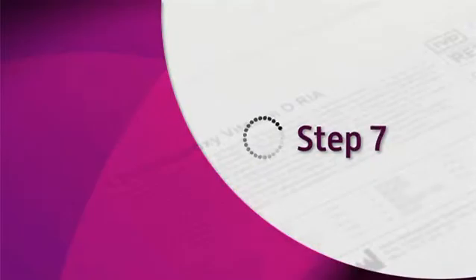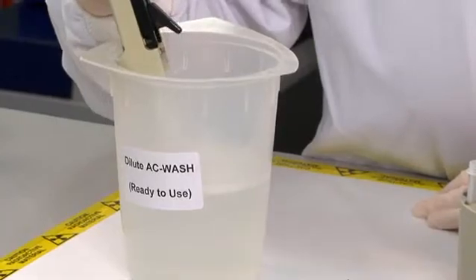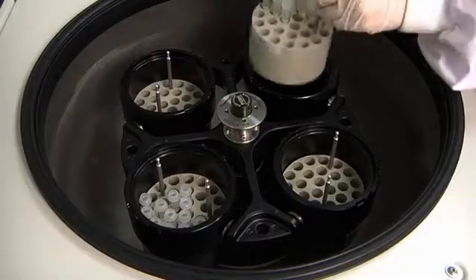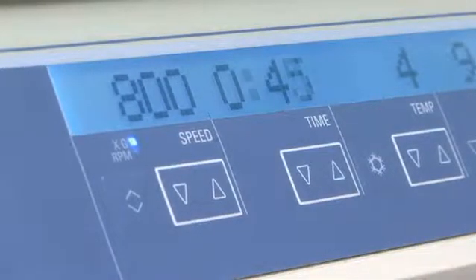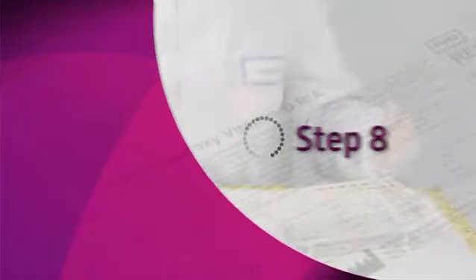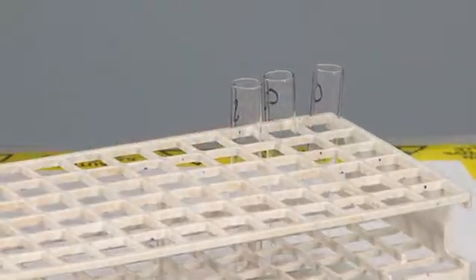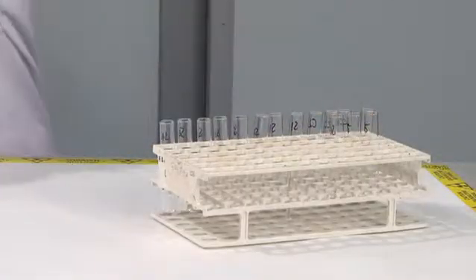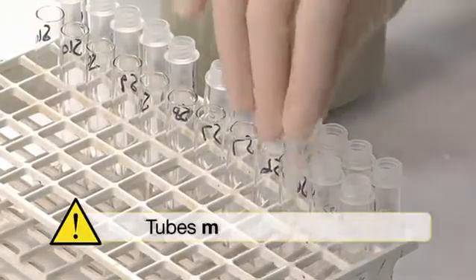Step 7: Prepare labeled borosilicate glass tubes, one for each immunocapsule, and transfer the immunocapsules to the glass tubes. Tubes must be borosilicate.